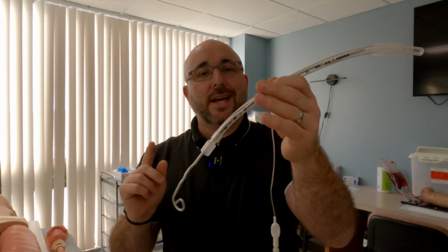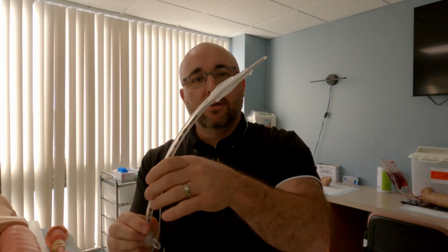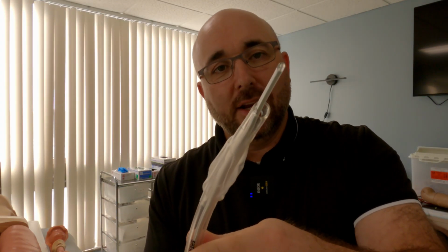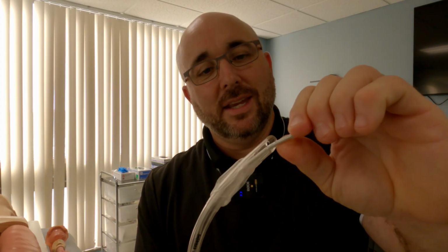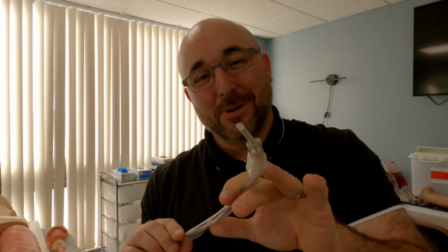Now that curl does not tell you much of anything at all, because if I go all the way down to the curl, you notice what's sticking out the end here. That's not good. That is a semi-rigid stylet sticking out the end, or I like to think of it as like you're trying to gore something. We do not want to do that inside of their airways, as you can imagine.